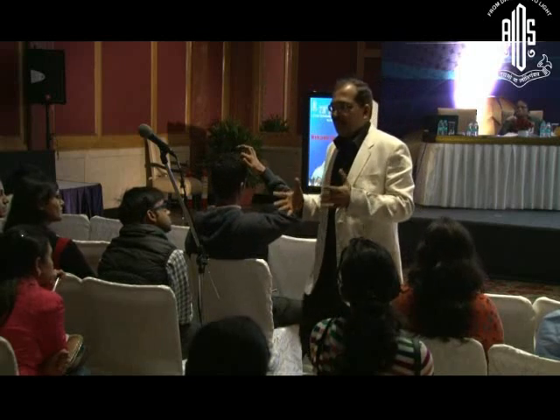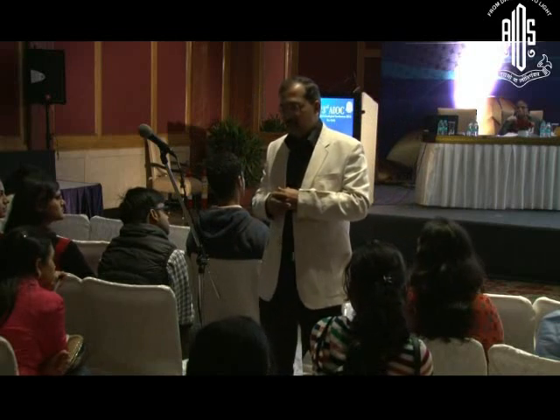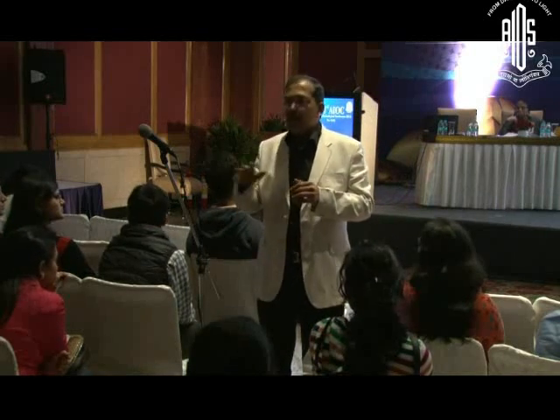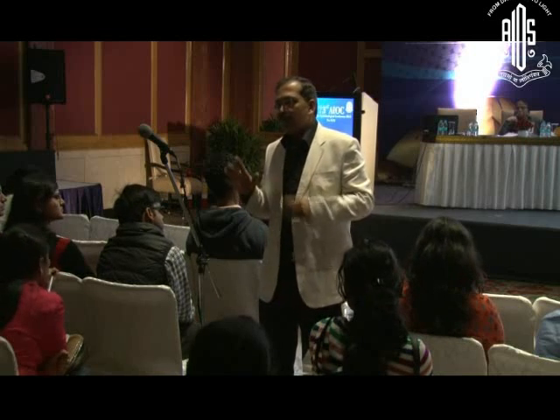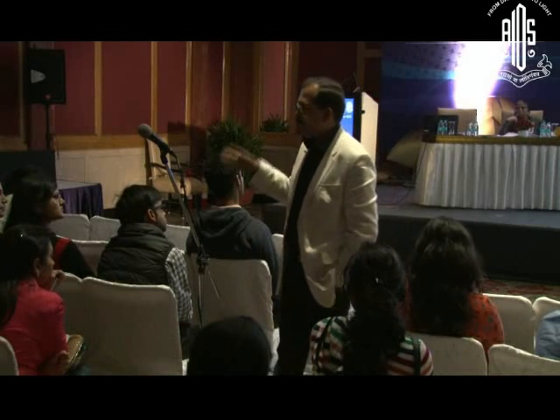You have trans-PRK, where even the epithelium is removed by the laser without touching, so no-touch surgery. There are various other ways, like corneal inlays and so many other things that you need to read up on. So we'll quickly finish. How can we understand whether this is feasible or not?